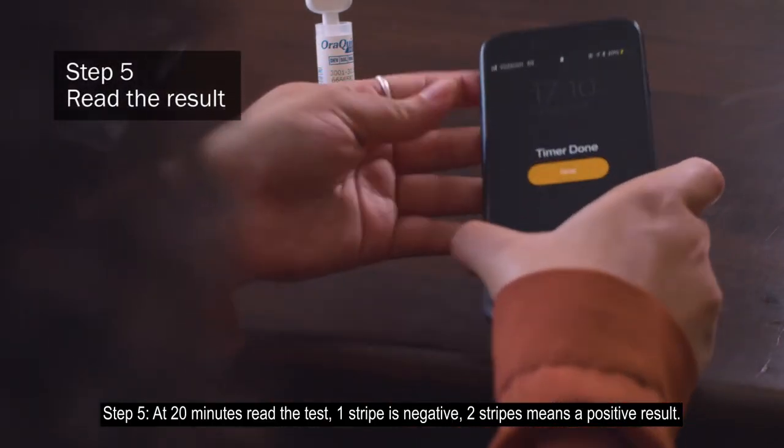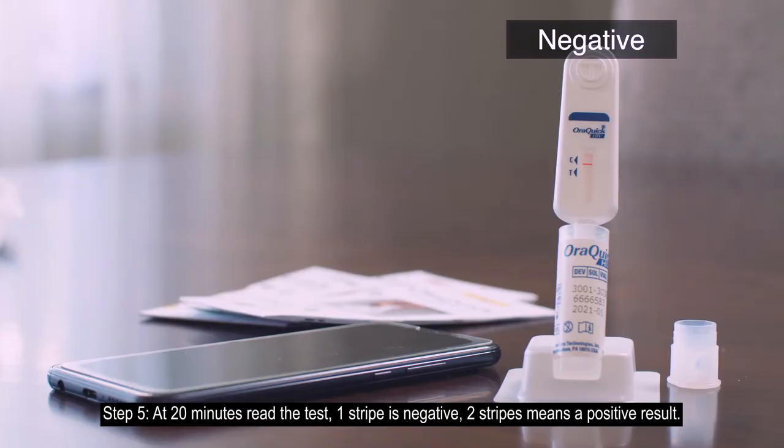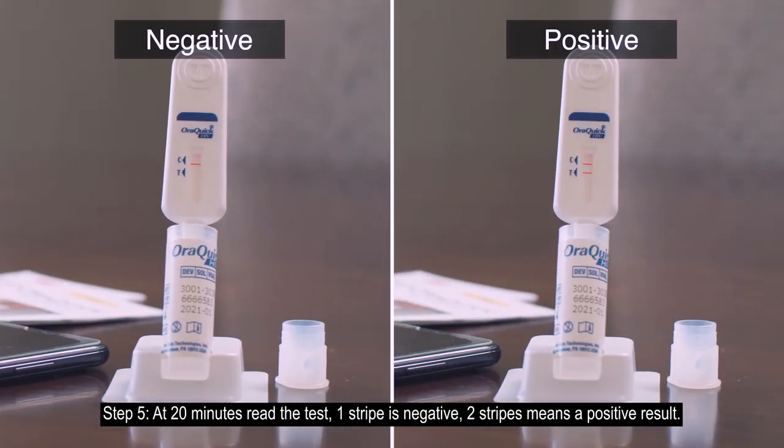Step 5: At 20 minutes, read the test. One stripe is negative. Two stripes means a positive result.